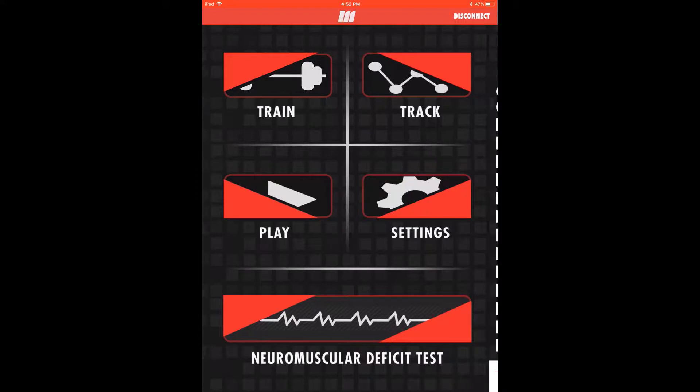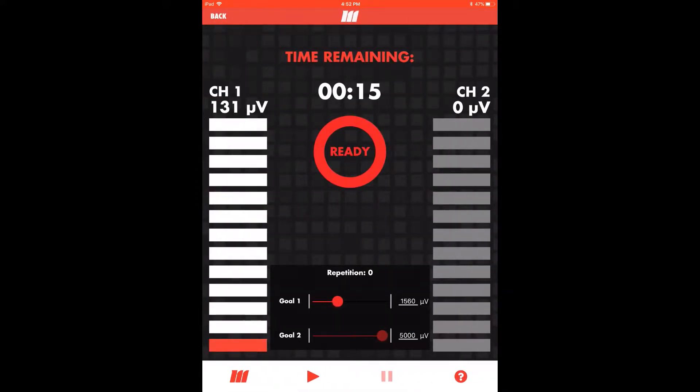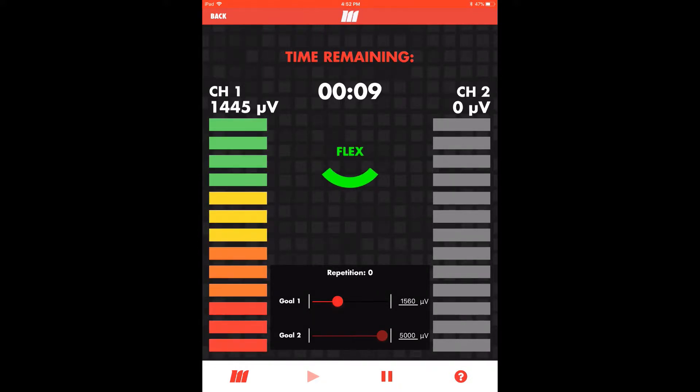Now entering the train module, we're ready to begin our biofeedback session. We'll first flex to test the signal and assess the appropriateness of our goal settings. If we find that the goal is too easy or too difficult to reach during a maximum contraction, simply adjust accordingly. Once ready to begin, hit the play button to start the session. Follow the timed prompts for relax and flex while trying to keep the contraction in the green zone on every rep.